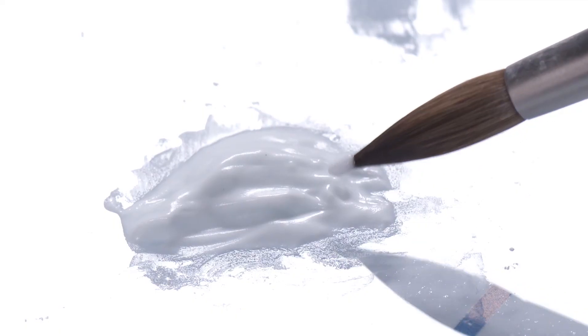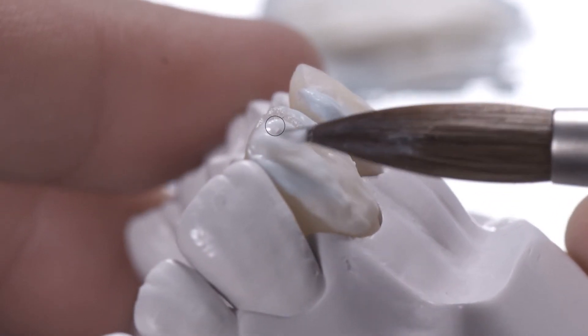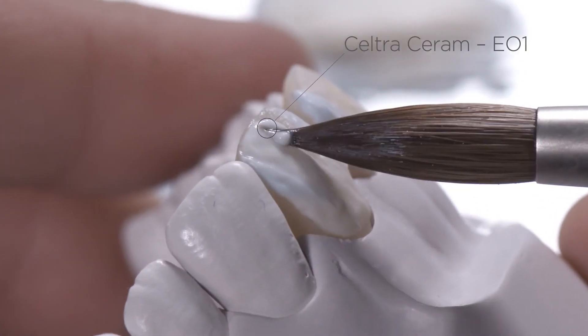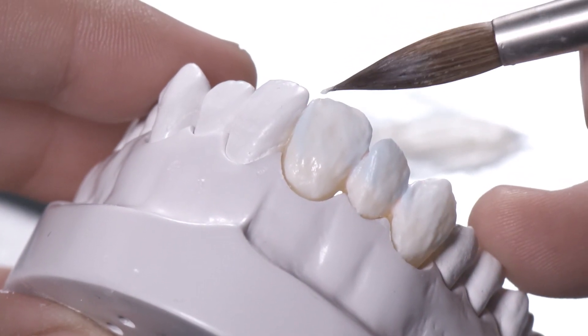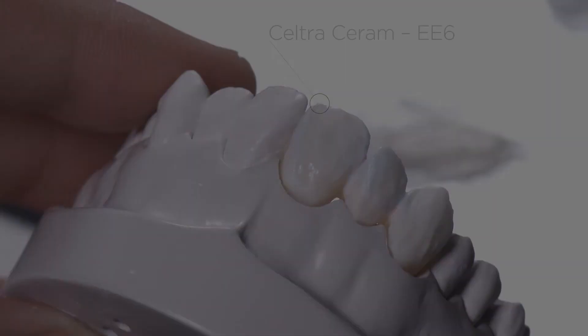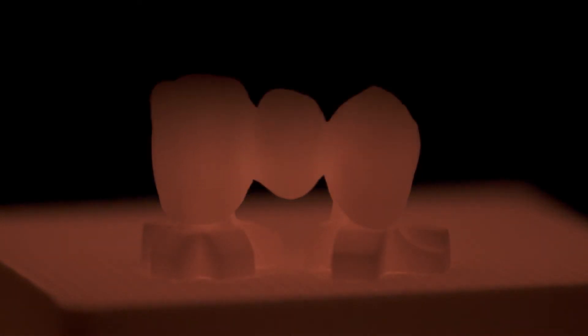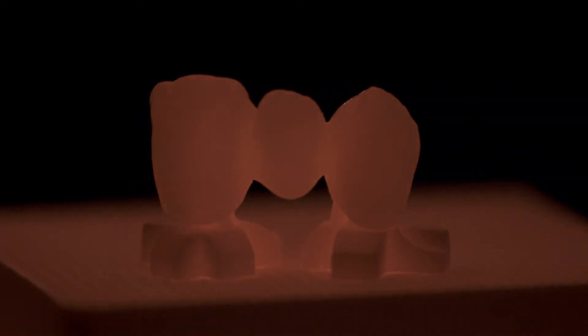Support the mesial and distal ridges with Seltra Ceram Enamel Effect EE5. In the central labial area, add a thin layer of the neutral enamel Opal EO1. Finalize the incisal edges with Enamel Effect EE6. After the ceramic firing, finalize the shape and create the desired surface texture.